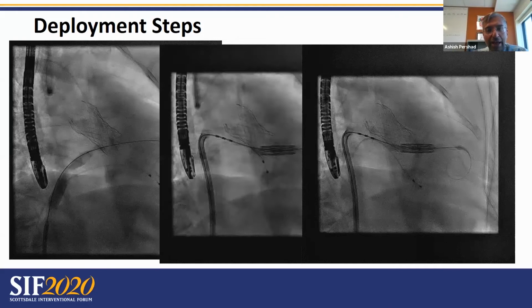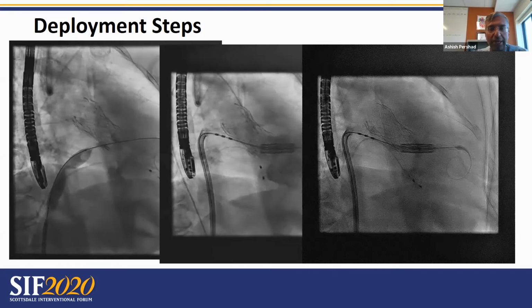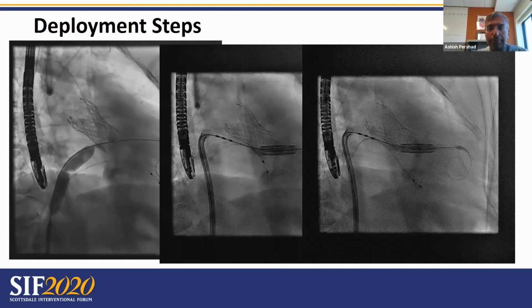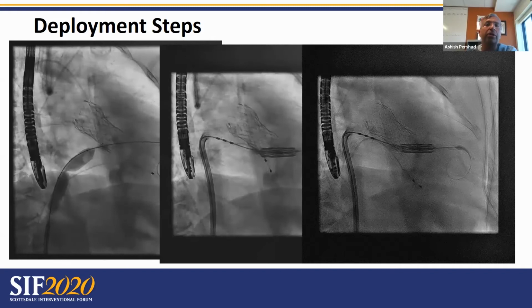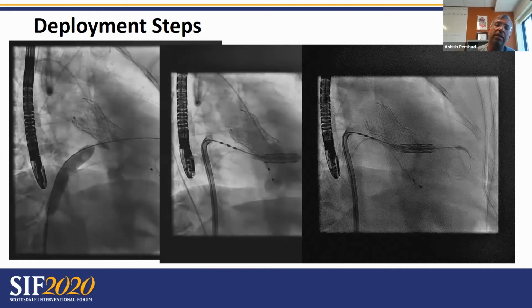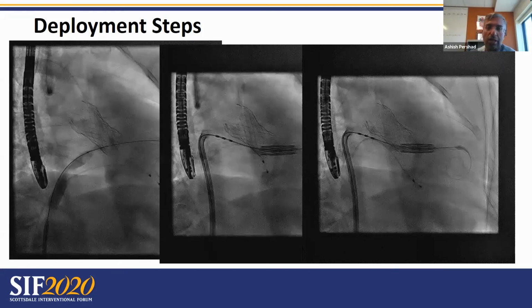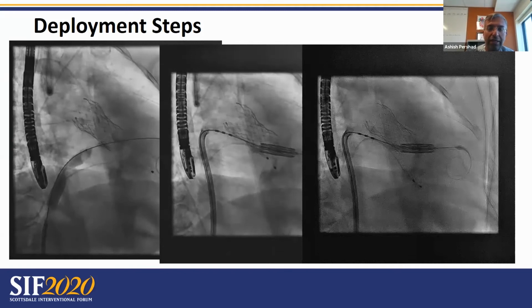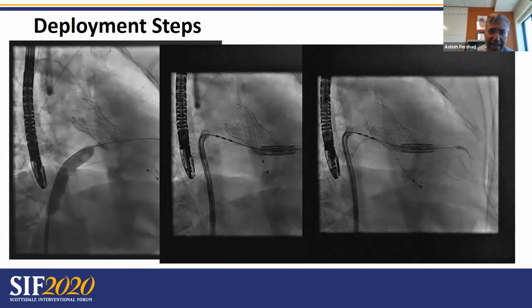On the left femoral access side, we have a pigtail catheter in the LV, a 5 French pigtail, with a 6 French femoral long sheath, so that at all times we're able to monitor in real time the presence of any kind of LVOT obstruction. We are able to keep that on our hemodynamic screen, and it may become relevant in a case like this, when we have borderline neo-LVOT numbers like we did in this case.